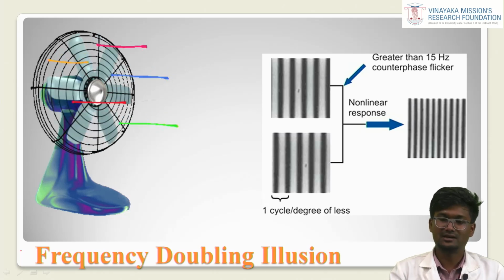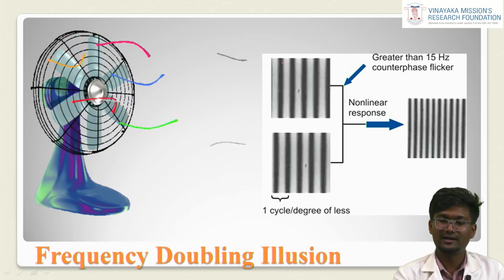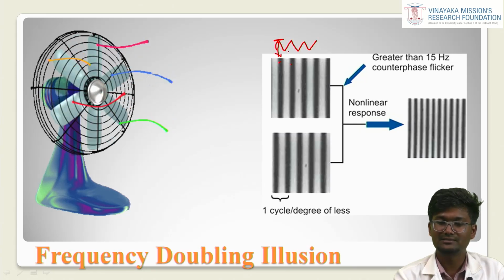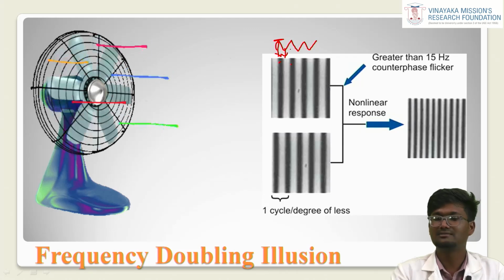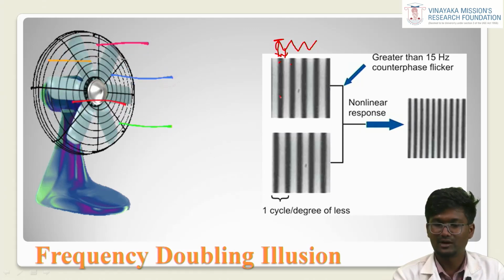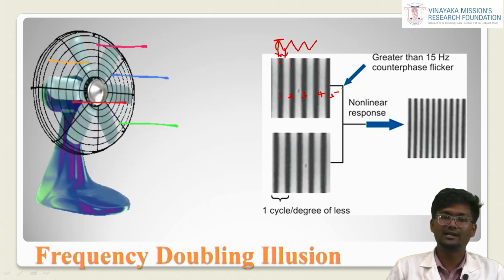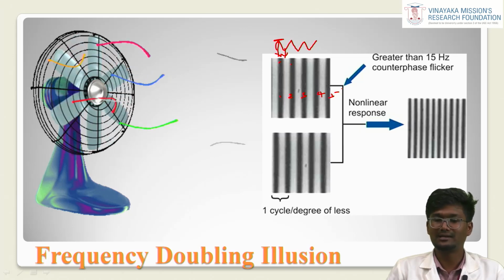Look at that chart. When we see a grid of black lines and white lines, the grid is nothing but a sinusoidal wave. A sinusoidal wave is a wave where the crest appears as black, whereas the trough appears as white. This is 1, 2, 3, 4, 5. Five square grids of sinusoidal waves are present in the upper image.